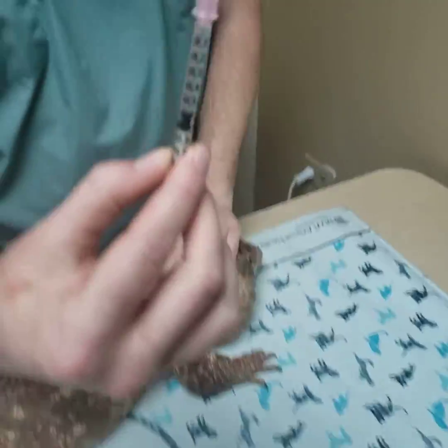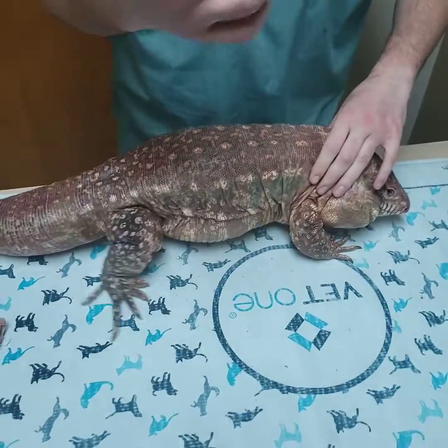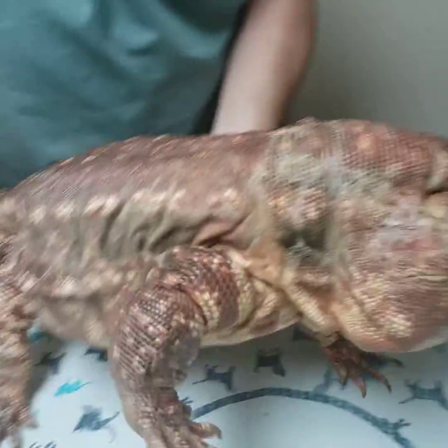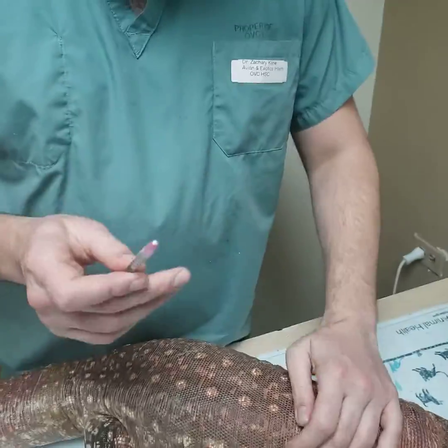So we've drawn up 0.6 milliliters of Fortas from our vial and thawed it out. We'll take off the cap — we have the needle available.